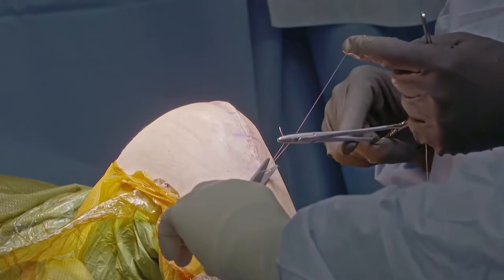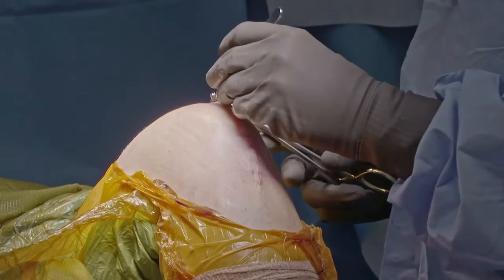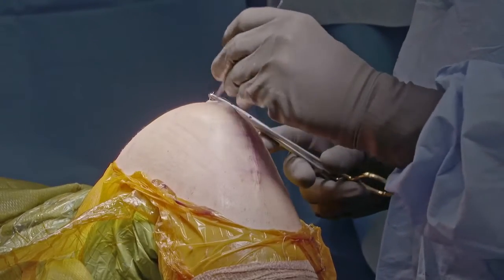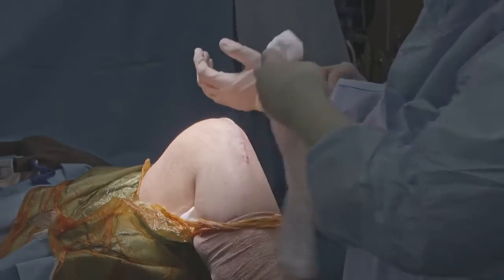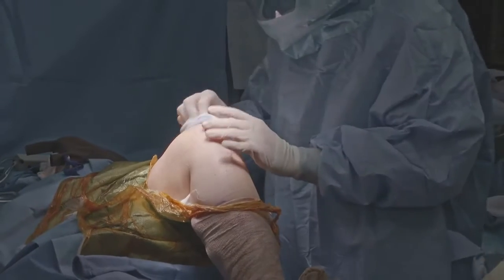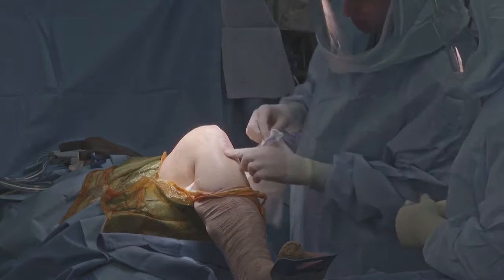It is important to carefully remove the iodine-impregnated drapes to avoid skin irritation. It is also important to thoroughly clean and dry the peri-wound skin area, as some patients may be hypersensitive if any adhesive is left on the skin.